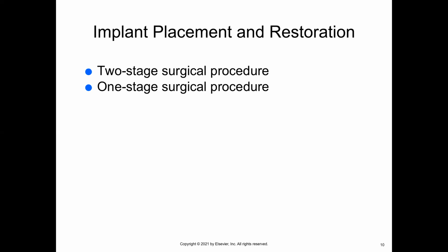A series of burrs starting off small and increasing in size to the size of the implant being placed are then used. Once the right size is reached, the implant is often screwed into place. A cover screw is then placed into the exposed area of the implant to prevent tissue from growing into the hole where the future abutment will be placed.